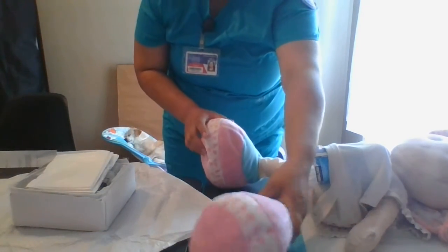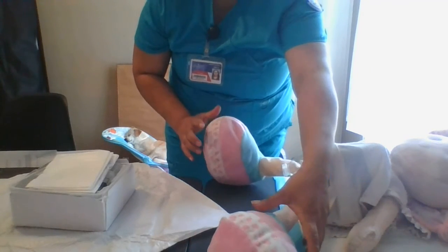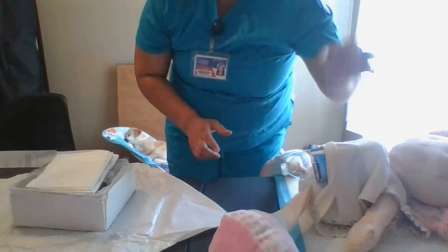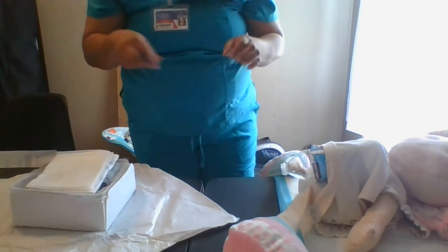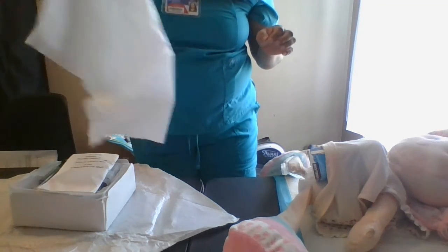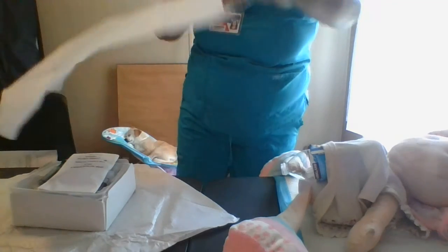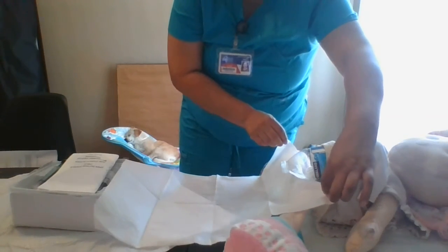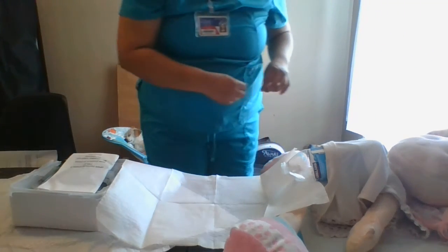I wouldn't have touched my patient's legs in real life because they would have stayed open, but I am right now for demonstration purposes. And my patient is in the dorsal recumbent position. Making sure not to cross the sterile field.